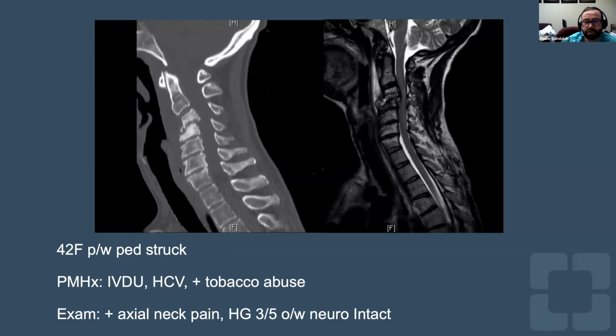The only time I don't use a plate is... the plate improves the deformity, right? It improves the lordosis. I think the plate is key in those situations when you have a deformity. If it's degenerative, for instance, and you have a 4-level ACDF, I'll do standalones in the front and then back it up in the back. If it's a non-deformity case. This is a deformity case secondary to an old infection.